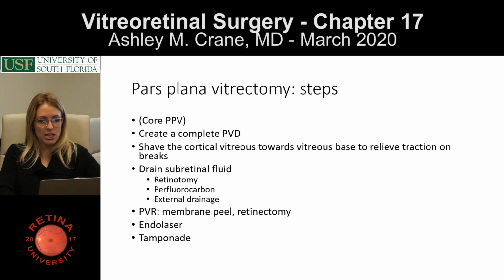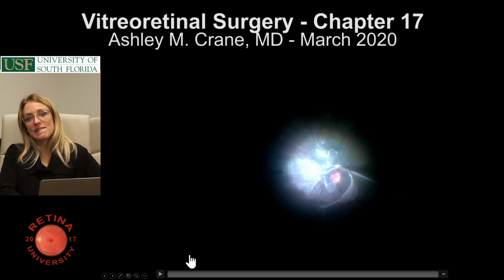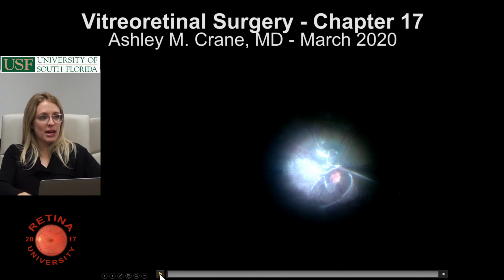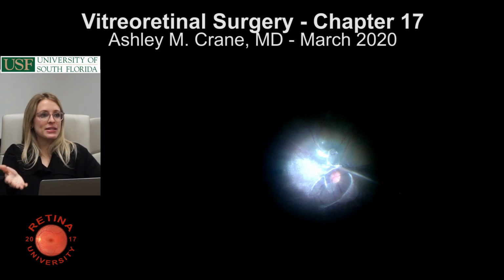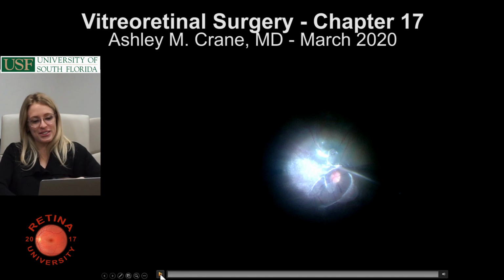So, great. What I also do is I'll take the intraocular cautery and just kind of mark, cauterize around the edges of the breaks. Yes. You mark the break, because when it flattens, sometimes it's hard to see where the tear is, so you know where to laser. Yes, and it doesn't bleed. That's a step for the surgeon's ease. You could theoretically do the whole surgery and not mark the break. It would still work, but it would be very difficult to see it.